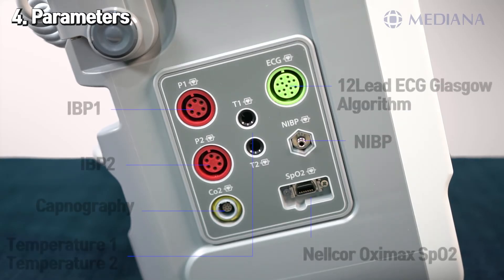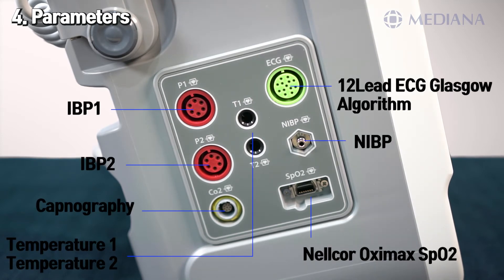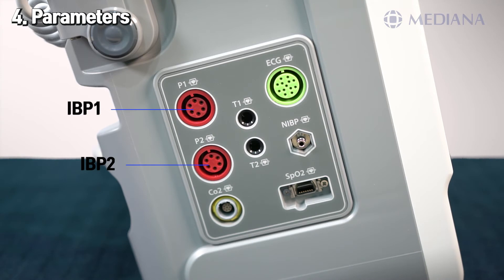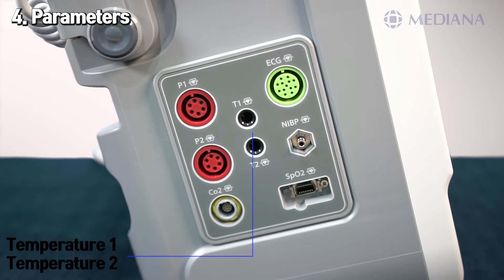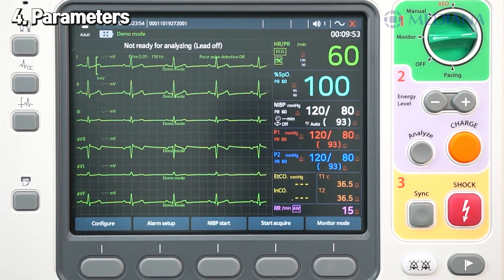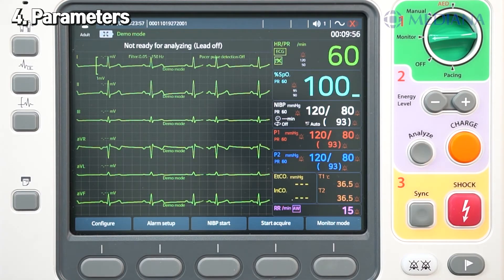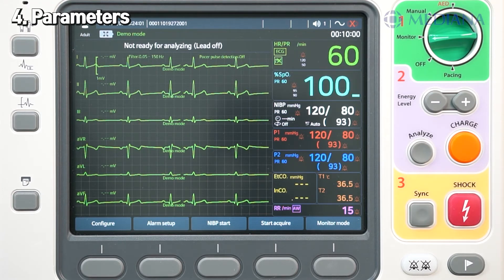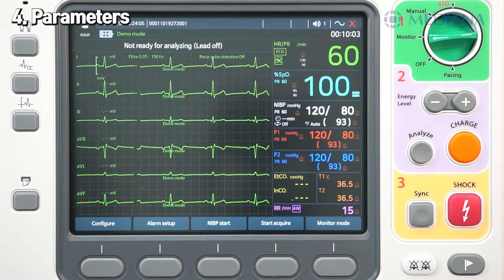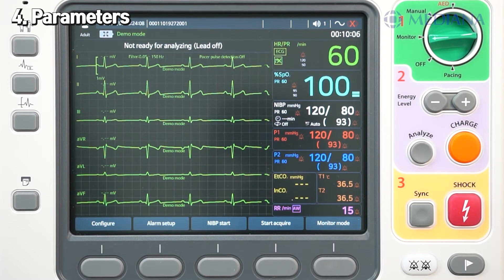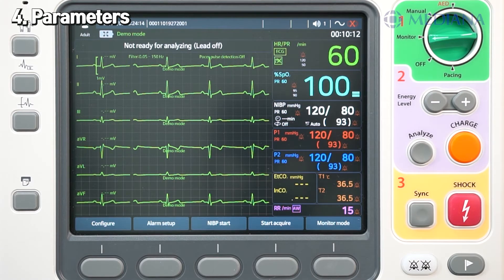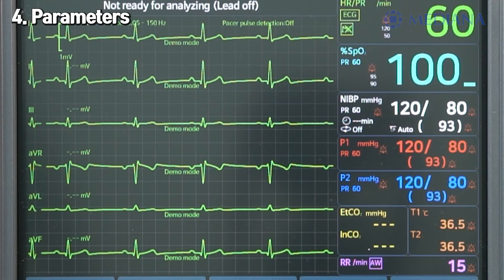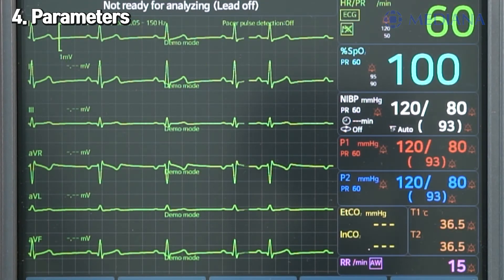On the left panel, there is an option case which includes various parameter connectors: two IBP connectors, an ETCO2 connector supplied from Philips Healthcare, two temperature connectors, and an ECG connector. The ECG algorithm used is considered best in class by cardiologists. Developed at the University of Glasgow in the UK, it includes signal processing, diagnostic interpretation of electrocardiograms from individuals of all ages, analysis of cardiac rhythm, and proven performance for STEMI analysis.